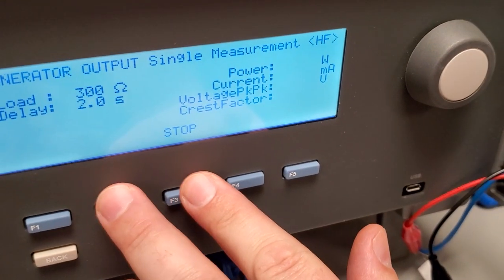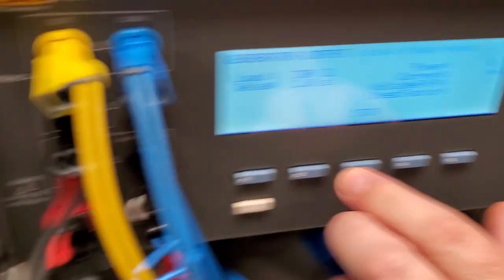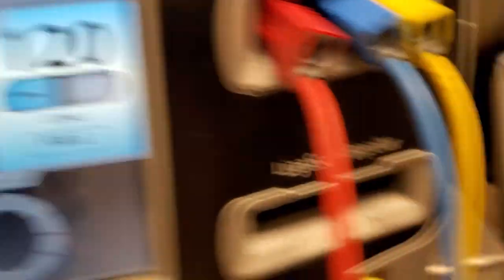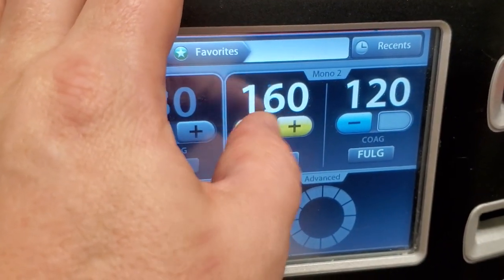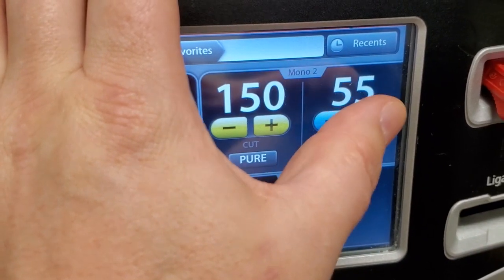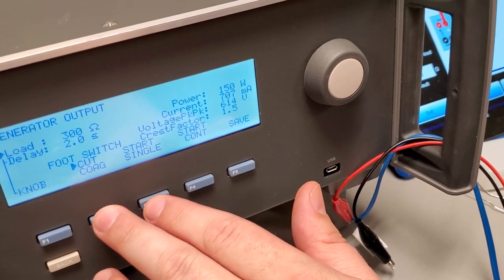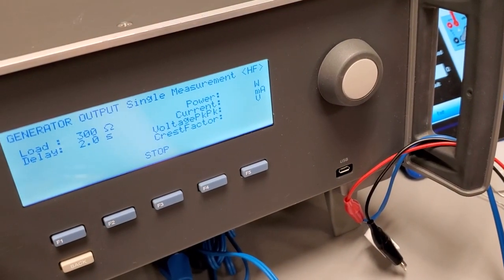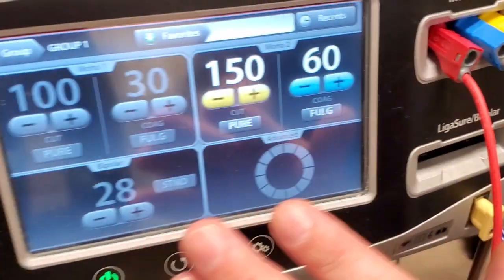Mono 2: I'm at 300 and 120. Start single on cut, then coag, start single. Now I'm going to go to half value — take it down to 150 for cut, 60 for coag. Cut, start single. You can see how fast this can go once you get into your rhythm — 59.7 watts. This guy is working excellent. Now let's get on to the bipolar.